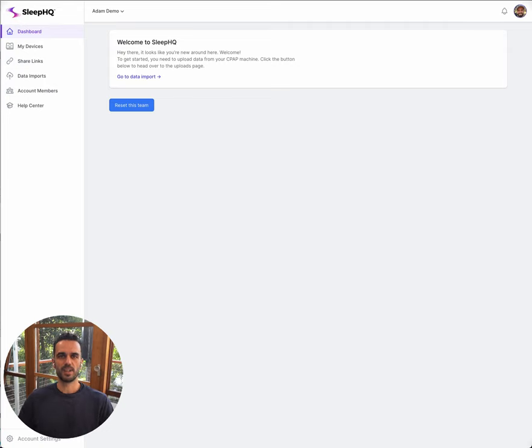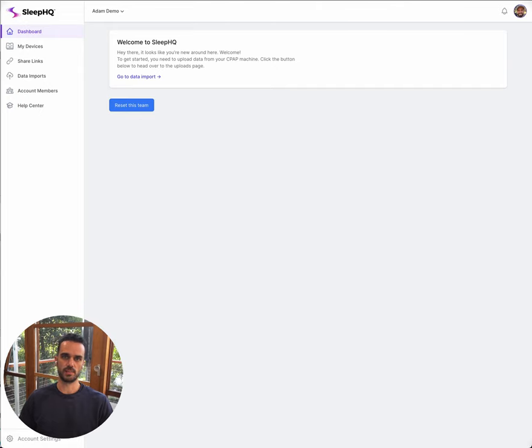Hey guys, Adam from Sleep HQ here. Today I wanted to do a quick video just walking you through the process of uploading your files into Sleep HQ.